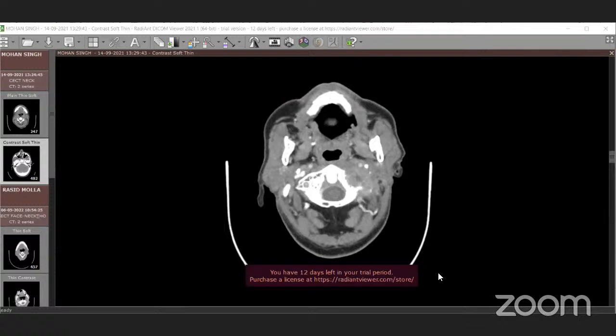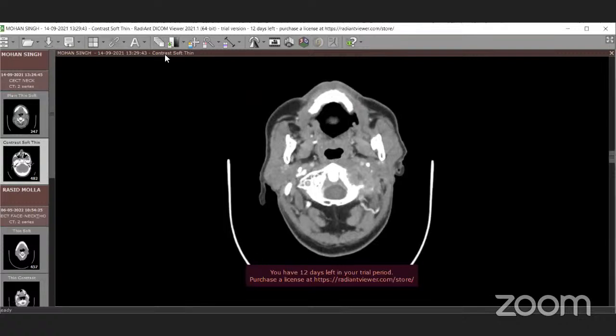We are not going to discuss the details of it, but we are going to take the proper tricky structures present in neck node contouring from Dr. Shaunak, our radiologist. On the next day, we will give you the spaces and all the borders. So we're going to start first with the oropharynx. Dr. Shaunak, over to you.